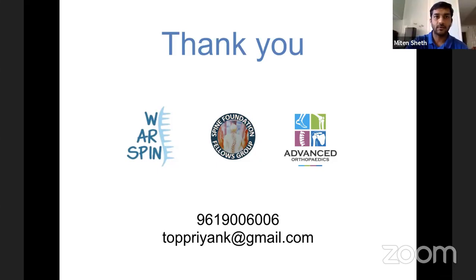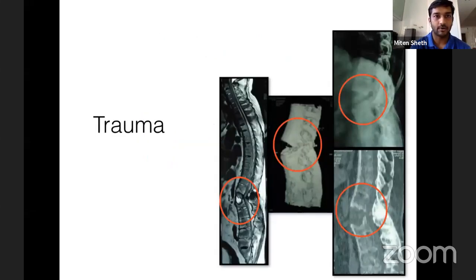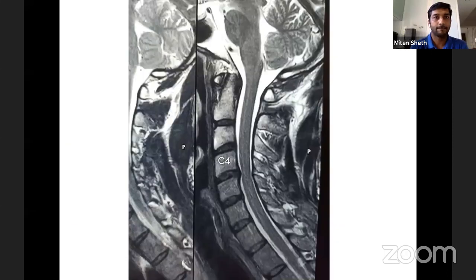Priyank, we have some questions on the chat box. Yes. Number one, do you have any images of the ligamentum flavum on a sagittal MRI? And could you then show us ligamentum flavum hypertrophy? How to pick that up?